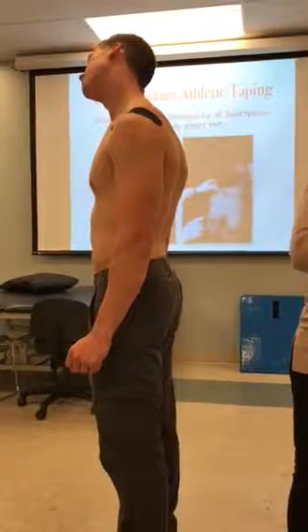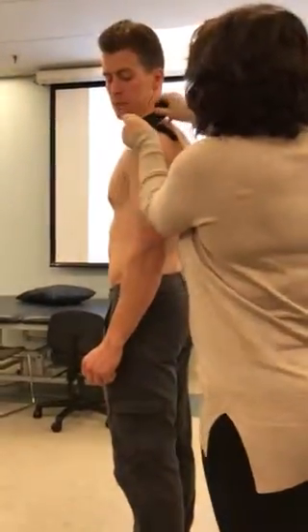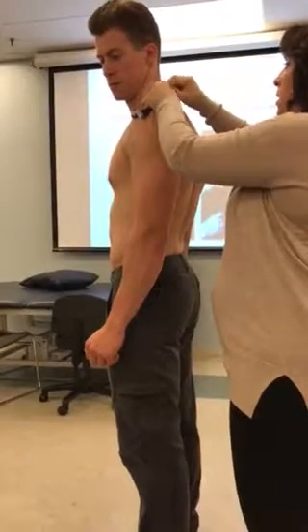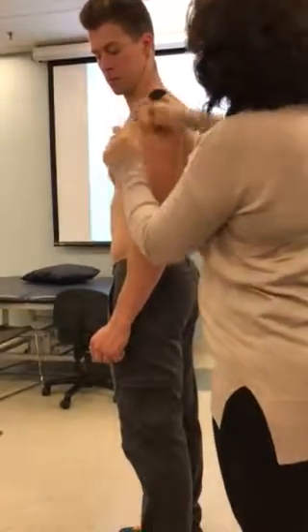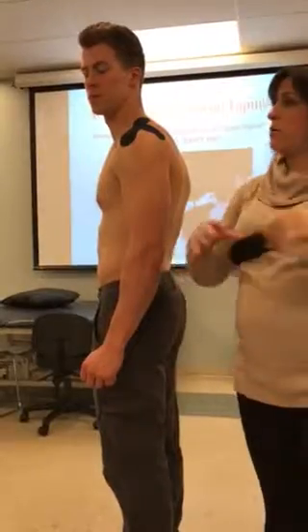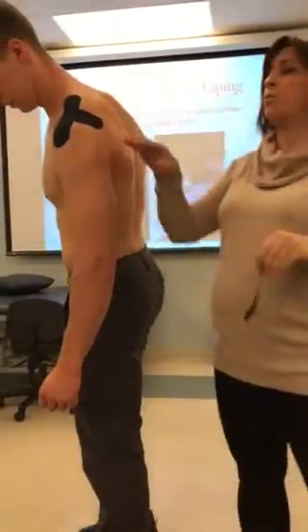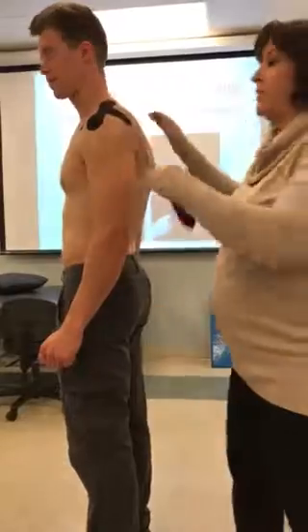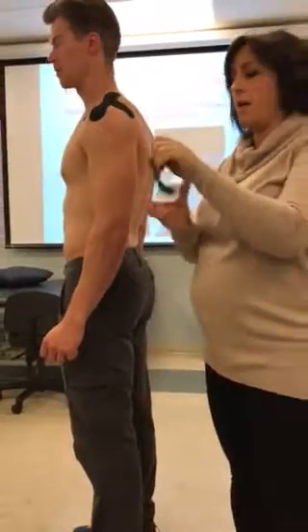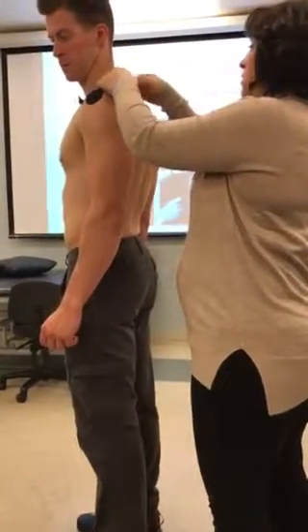So I had an athlete, he was a Brazilian Jiu-Jitsu player who sprained his AC joint. No step deformity, just pain, pushed it back down. And when he was ready to go back into play and to compete, we did this one because it was so easy. He could still move his shoulders and do what he needed to do. But I wasn't really worried about the step deformity because he didn't have one. I was more worried about just keeping this stabilized, so that if somebody kind of squeezed him, there would be some support for the AC joint. And then again, just pressing it down, creating that star technique.